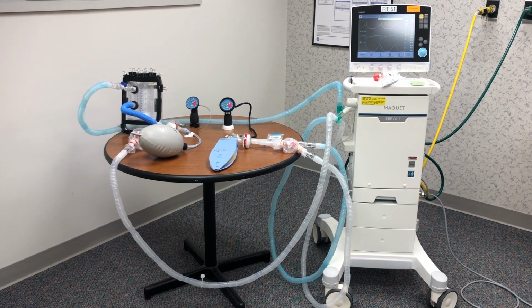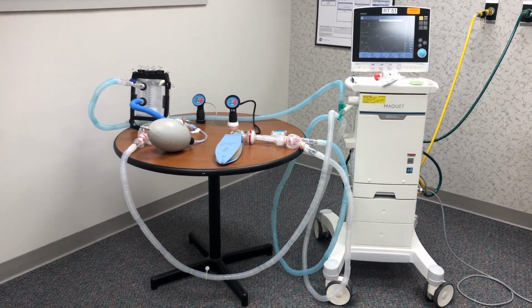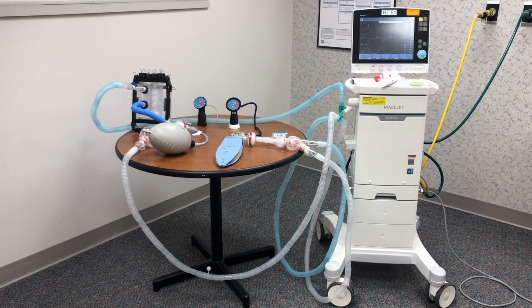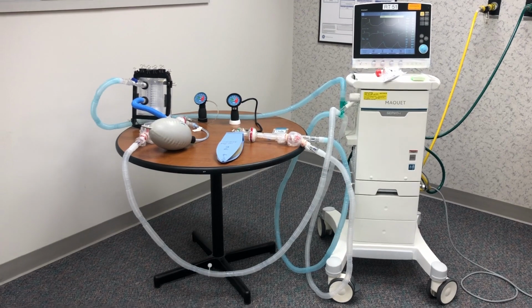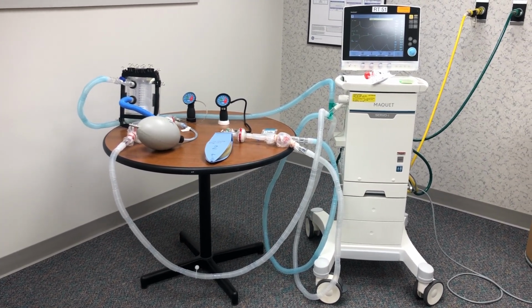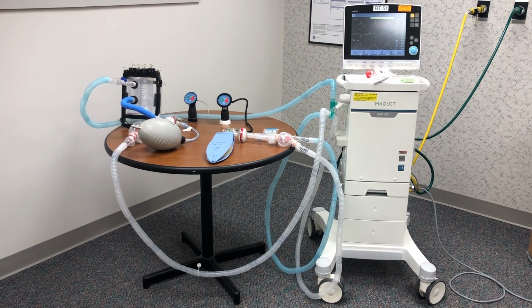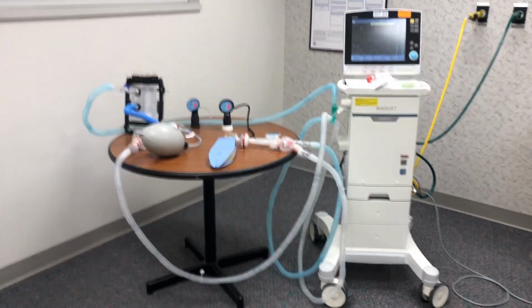So those are the key things. I think there were concerns. There is minimal cross contamination, and we can change settings on one patient at extreme levels without changing any significant parameters on ventilation on the other patient.